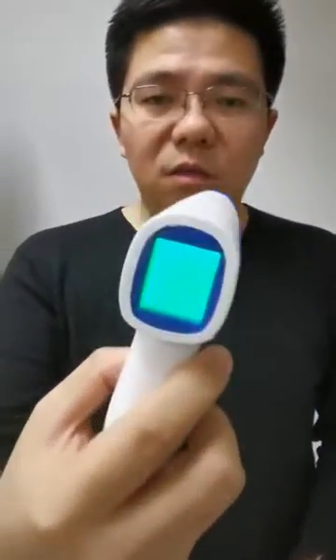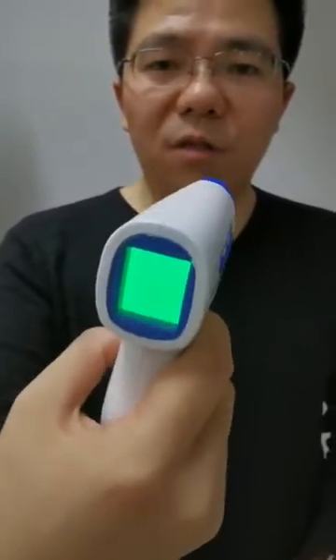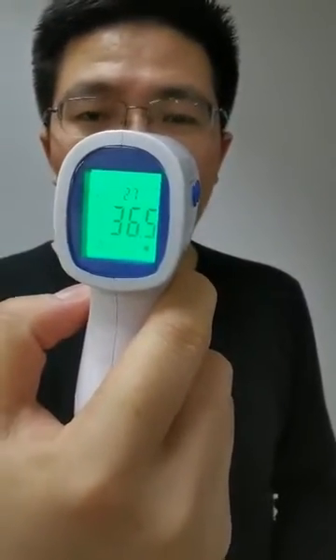If it's the first time you use it, sometimes you may need to press two times, and the screen will tell us it is 36.3 degrees centigrade. If I want to measure someone's forehead, I should put it like this and press it. The screen tells us it is 36.5 degrees centigrade.